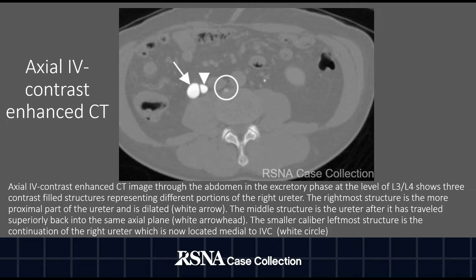Axial IV contrast-enhanced CT image through the abdomen in the excretory phase at the level of L3-L4 shows three contrast-filled structures representing different portions of the right ureter. The rightmost structure is the more proximal part of the ureter and is dilated, as indicated by the white arrow. The middle structure is the ureter after it has traveled superiorly back into the same axial plane, as indicated by the white arrowhead. The smaller caliber leftmost structure is the continuation of the right ureter, which is now located medial to the IVC, as indicated by the white circle.